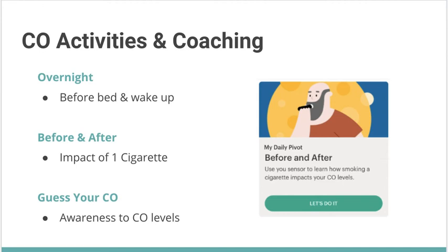They can also guess their CO level. This is kind of a fun game for them where they might say, oh, I think my CO is 15. In reality, it might be 6. And that's something you can talk about with the user. Maybe they waited several hours before smoking a cigarette, or they may guess too low and not understand the impact that cigarettes have on their CO levels.